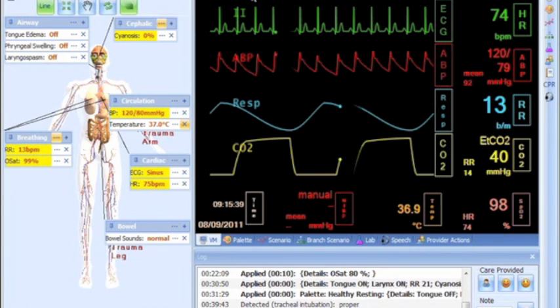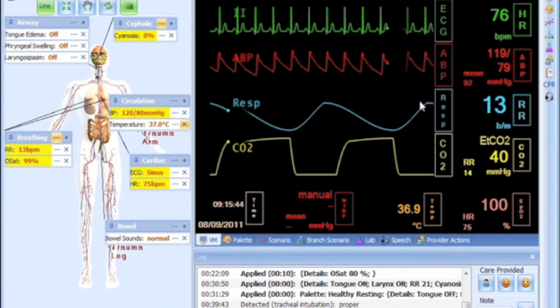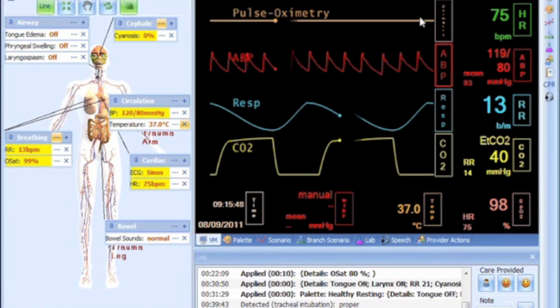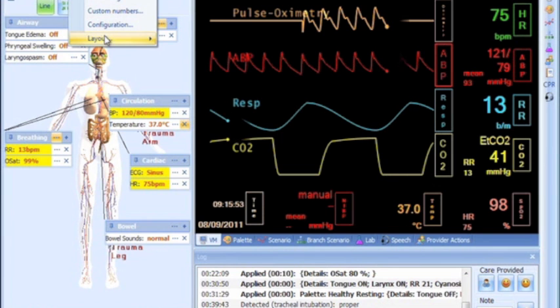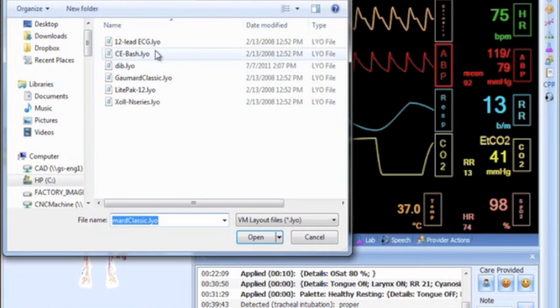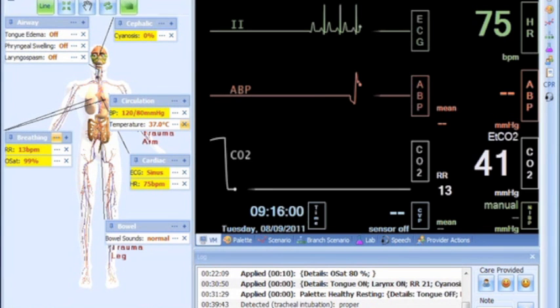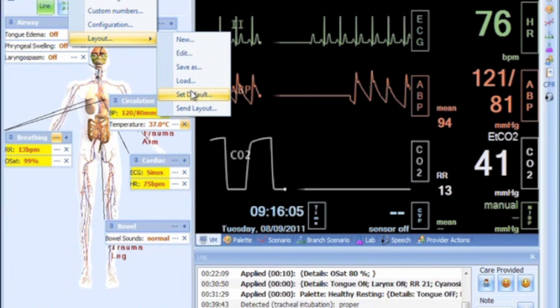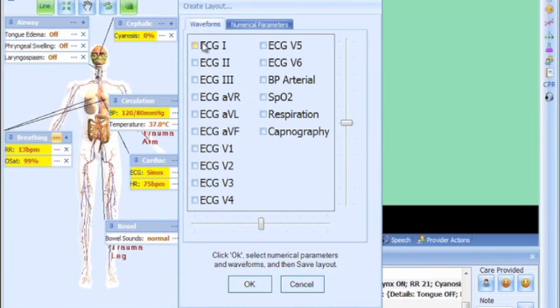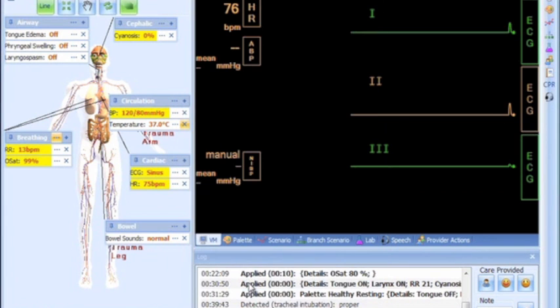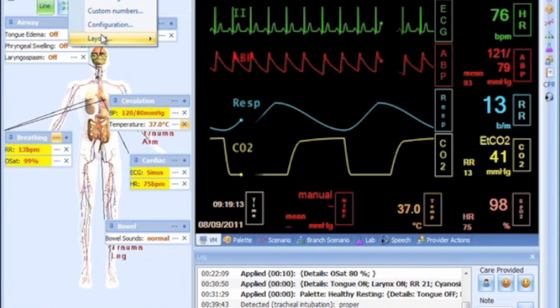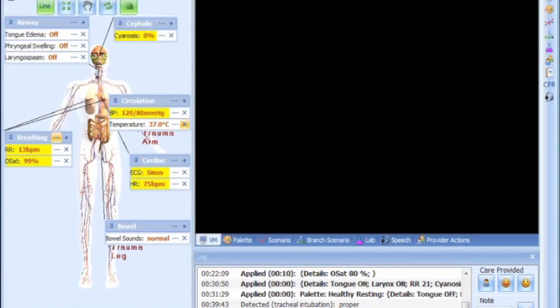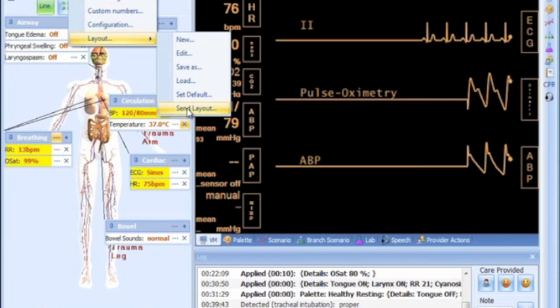The virtual monitor accessible to the instructor reflects what care providers see on their monitors. It also works as a status viewer for the vitals you want to keep track of without having to overcrowd the status panel. The instructor has the capability to select different monitor layouts or create custom ones if desired. The current layout can be wirelessly transmitted to the provider's virtual monitors, allowing the instructor to control what vitals care providers see.